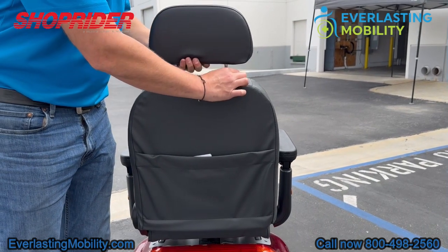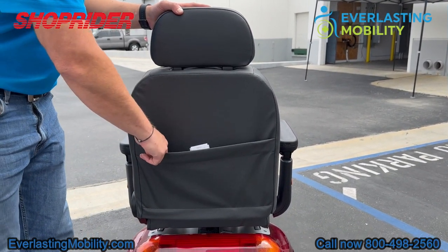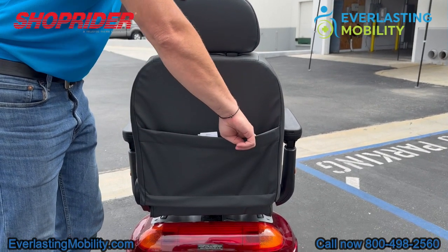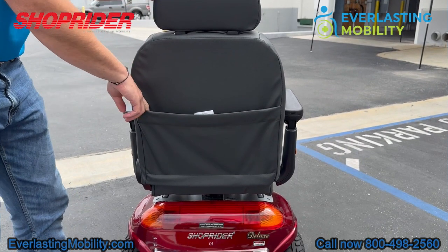The headrest adjusts up or down. There's also a large storage pouch on the back of the seat, so you can put things in here like your charger, for example. It might be a good idea to keep that in your scooter so you have it with you at all times.